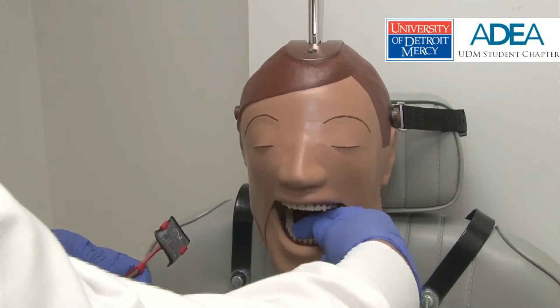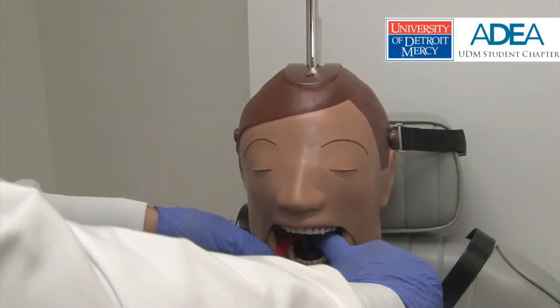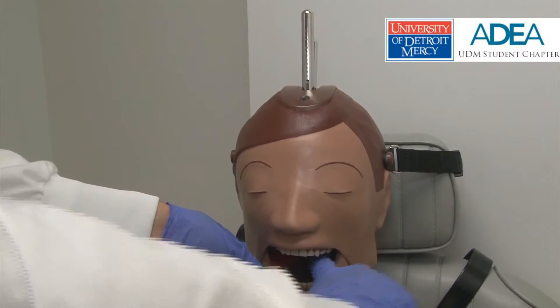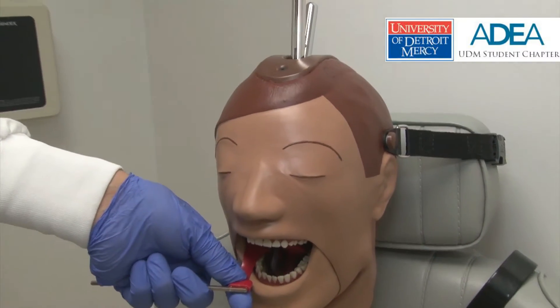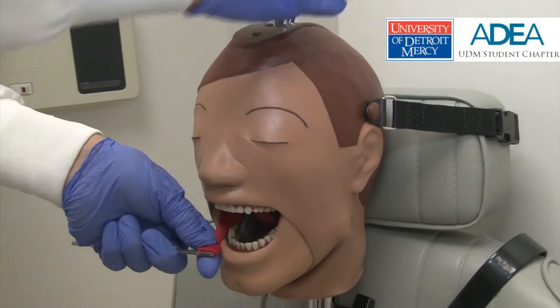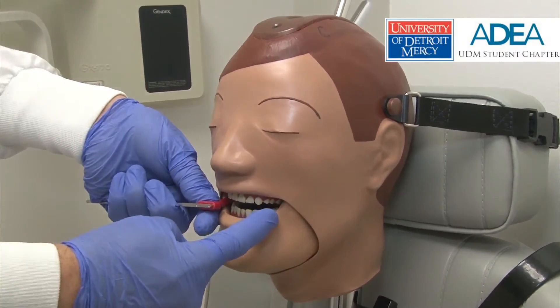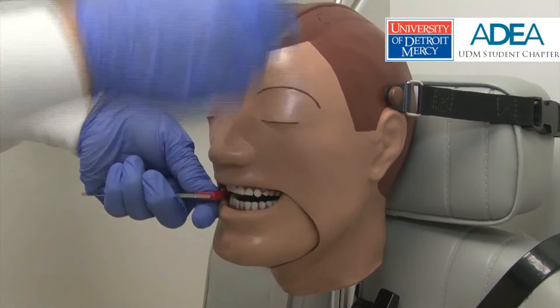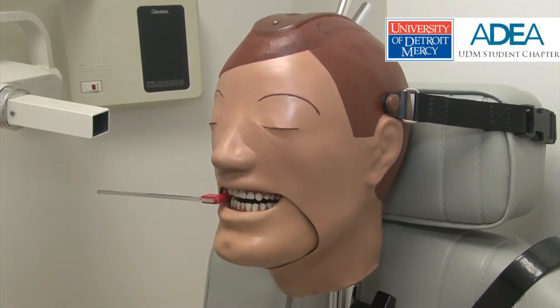Using two hands, the tongue is retracted, and the XCP holder is positioned in the mouth. The tongue is released, allowing the holder to retract the tongue. This frees up the operator's hand to start to close the mannequin's mouth. This relieves pressure at the commissure and the buccinator muscle, allowing the operator to position the sensor in the proper position.